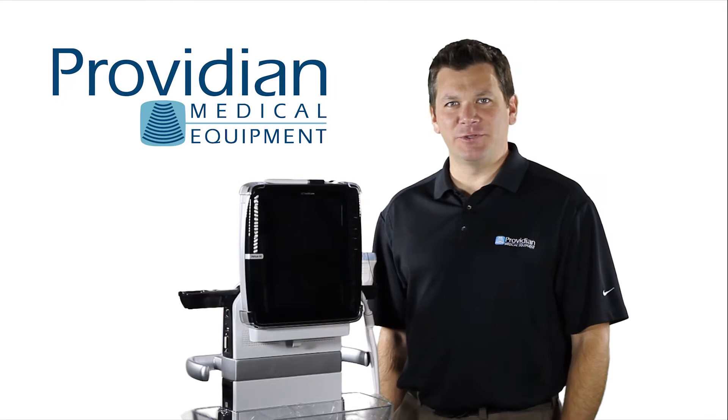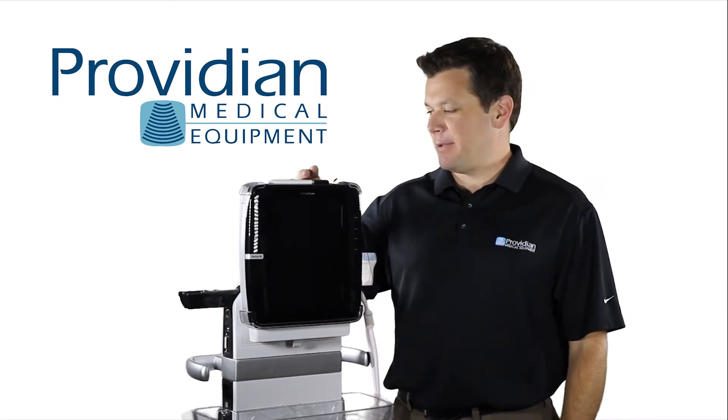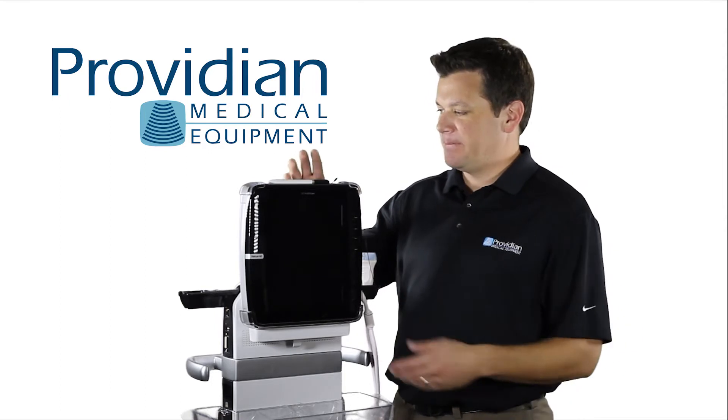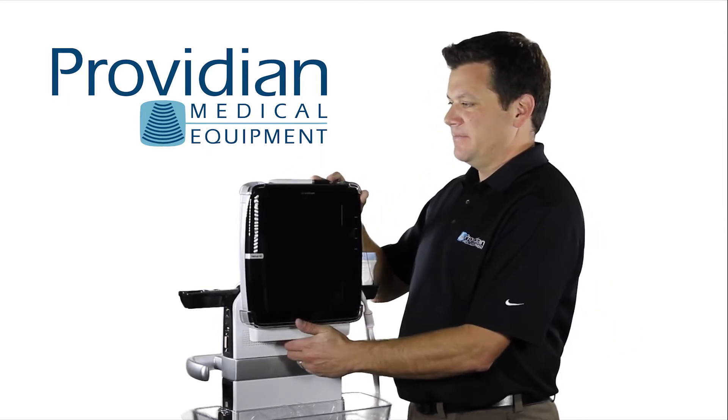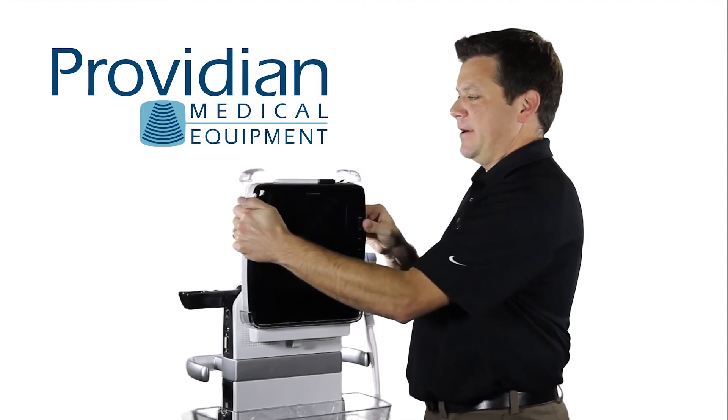Hi, and welcome to the GE Venue 40 training. Before we get started, I wanted to talk a little bit about the cart and how it operates. When you get the system, this won't be connected. I'll show you how to connect the system and how to operate it from there.